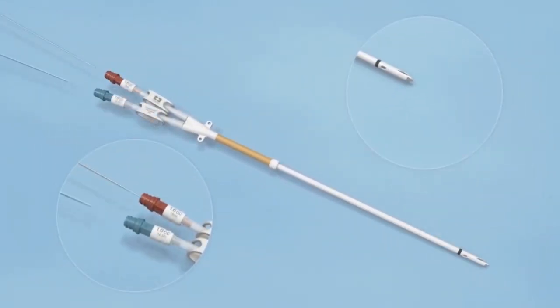Ensure that the white, flat side of the longer stylet containing the stylet side hole is oriented against the septum of the catheter lumen. Advance the stylets all the way through the catheter and lock the back end of both stylets to the catheter hubs. Be sure the catheter clamps remain open to ensure the stylets are not damaged.